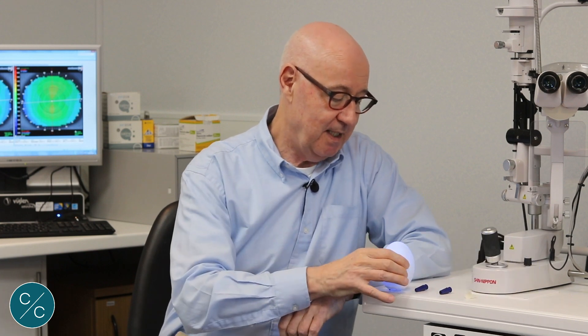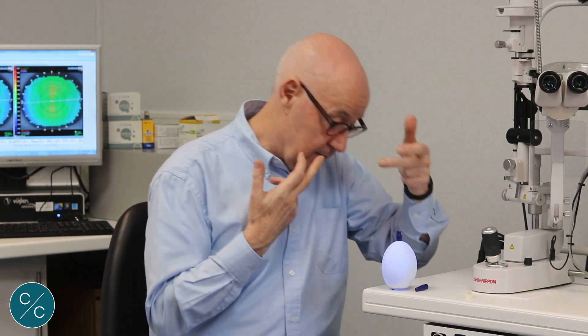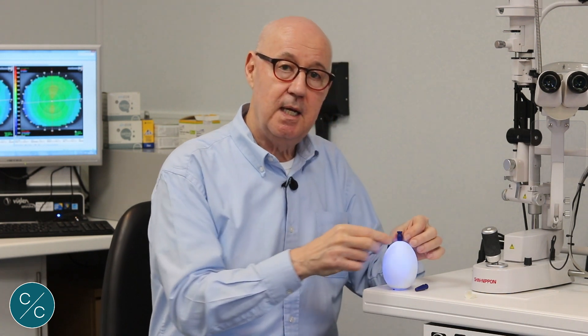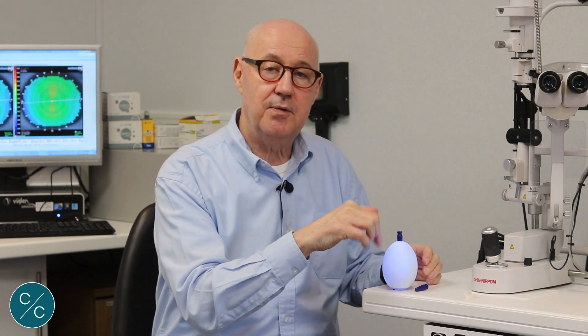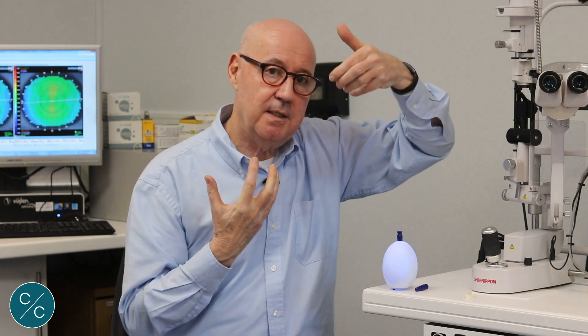A really interesting extension of that idea is this illuminated egg that a practitioner in Italy introduced me to, whereby the trimmed sucker is placed into the top of the egg. As the patient lowers themselves onto the lens, they can actually see the light through the sucker itself. This leaves both hands free to open the lids and is quite useful for patients that have severe handling difficulties.